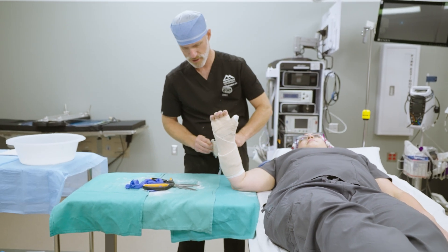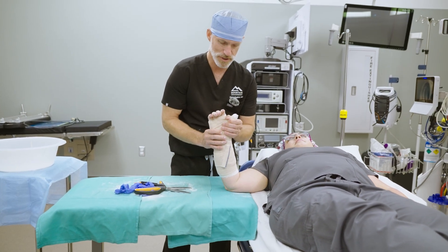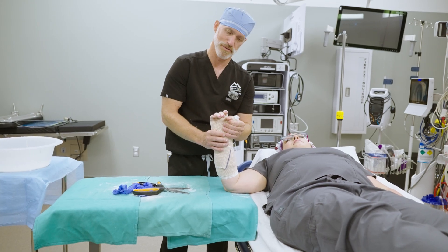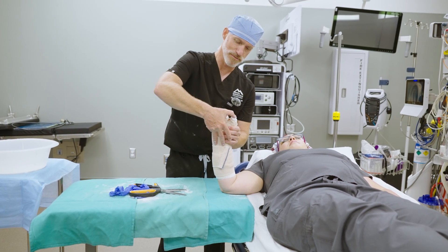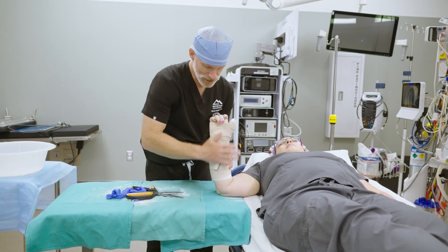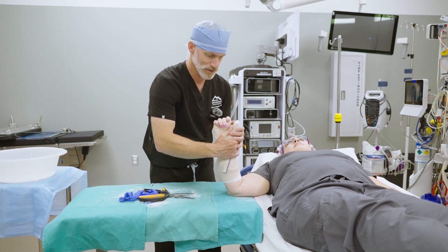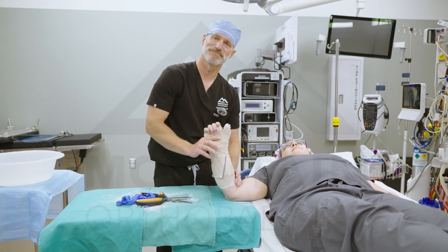Usually what I do as this dries is make sure it left enough motion available for the thumb if we're doing an IP joint free. So with this one where we're keeping the IP joint free, I'll actually move the patient's thumb and make sure the plaster is not impinging on the thumb and there's plenty of motion. As the plaster cures, I'm just going to hold in here and stabilize this exactly how I want it.